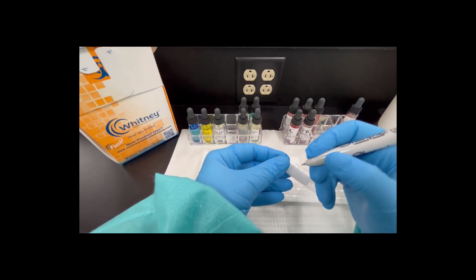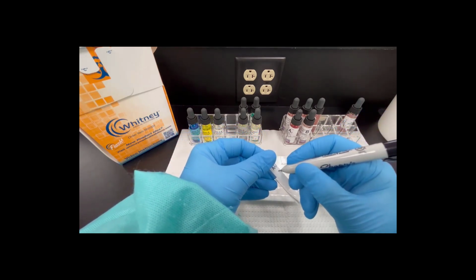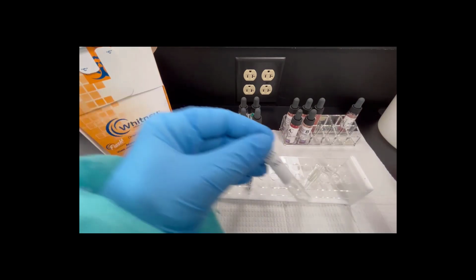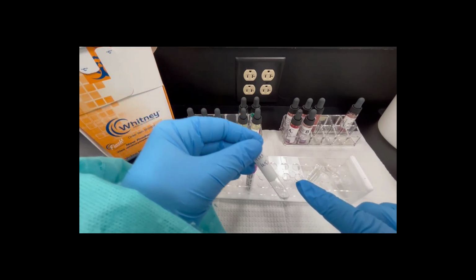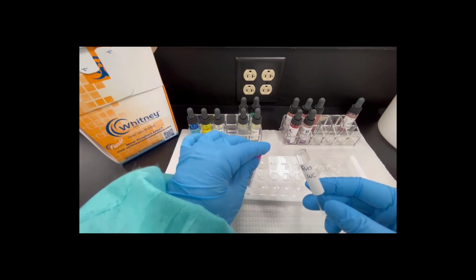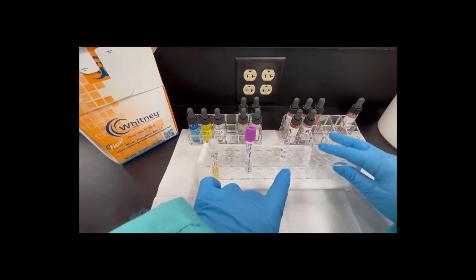What we're going to do is write on the tube the first 3 digits of the last name, and then WC. Now, wherever this tube lands, if for some reason I've got multiple racks out and I put it in the wrong rack, I know that I have this patient's washed cells. So we're going to label it. We always label it across the top like this, so when it's in our rack, we can actually see what it is.